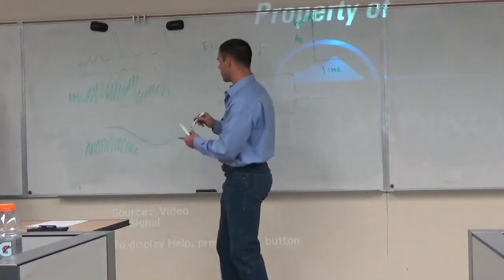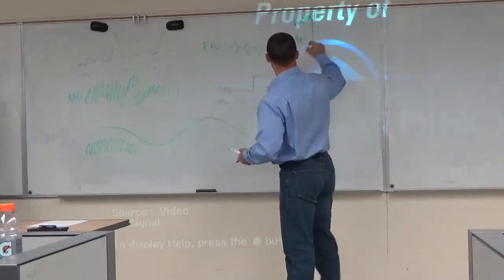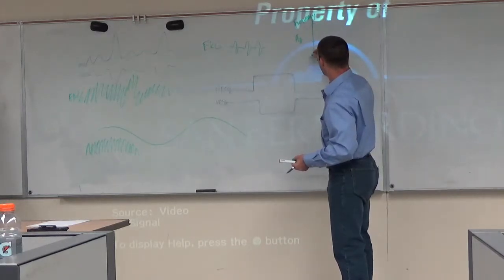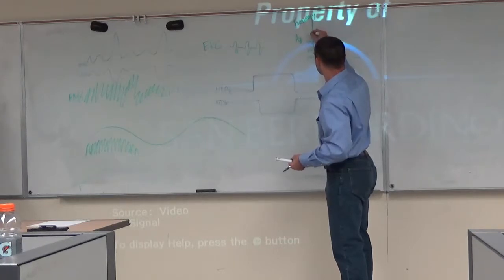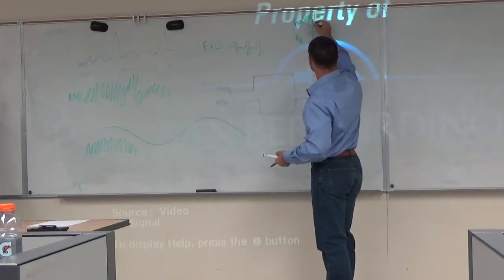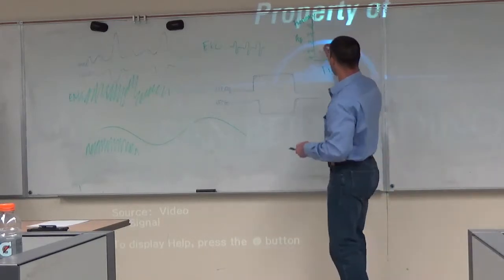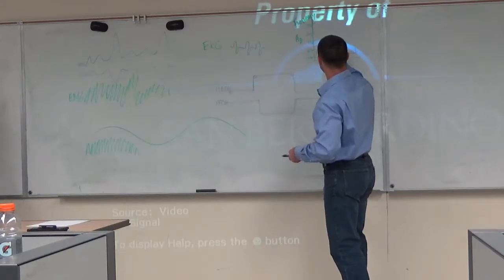And let's call this basically a slow wave and a fast wave. You can characterize that in different measurements. So let's just say we have about 4 hertz here. Let's call this 8 hertz. Let's call this 12 hertz. Let's call this 20 hertz. Let's call this 40 hertz. So from 8 to 4 over time, this is basically what we call theta.